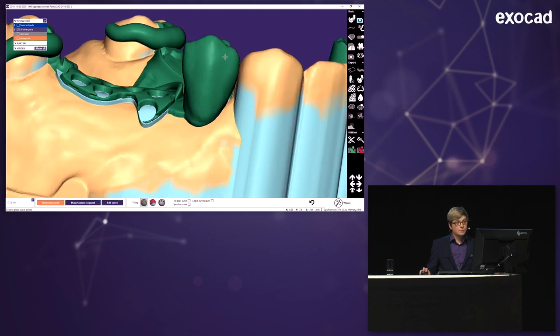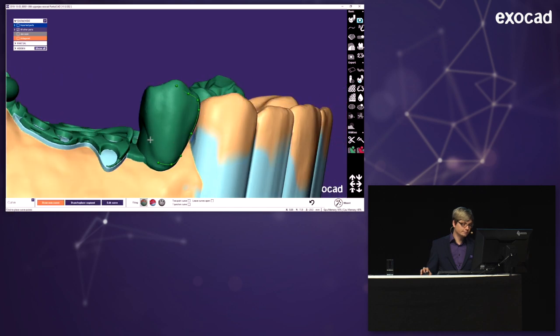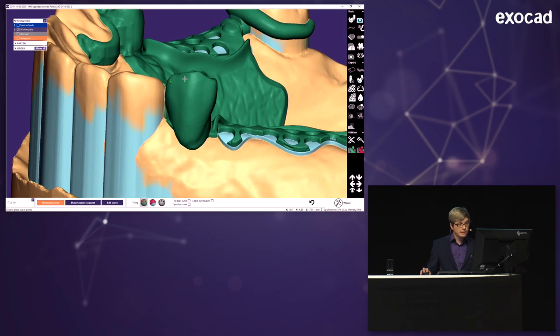Because I have the metal dummies here, and maybe I want to use some kind of veneering technique with acrylic, I'm just drawing a curve here. And I'm doing the same one for the other metal dummy. So those only end up as being metal backings, not complete metal dummies.